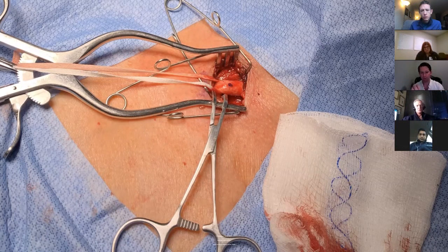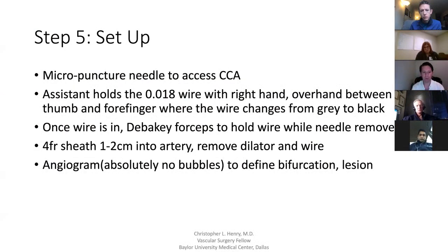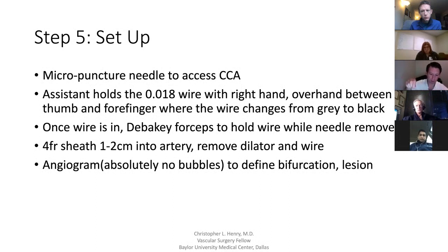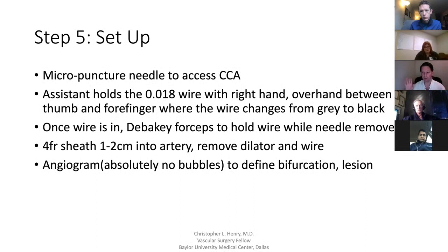The Profunda clamp is already in place underneath, ready to go, and at this point you've got a really nice working field. Use micropuncture to access the common carotid. Dr. Grimsley emphasized: we're typically on the left-hand side of the patient, but hold with your right hand, overhand to the wire right where the wire changes from gray to black. That way he doesn't have to look up when coming to grab the wire — he knows exactly where you're holding it, just slides it in. It's about a centimeter and a half to two centimeters outside the tip of the needle — it's not going to go across the lesion.